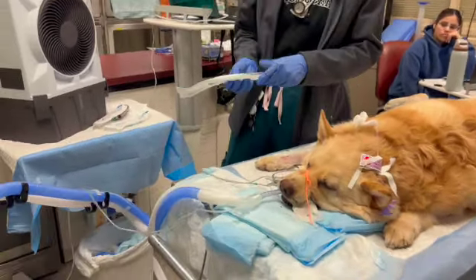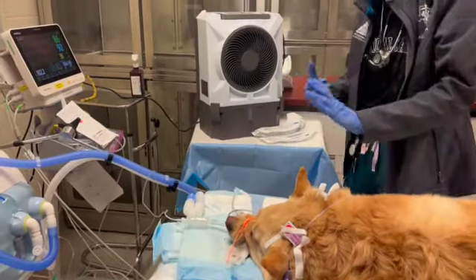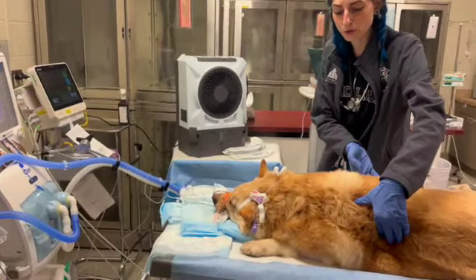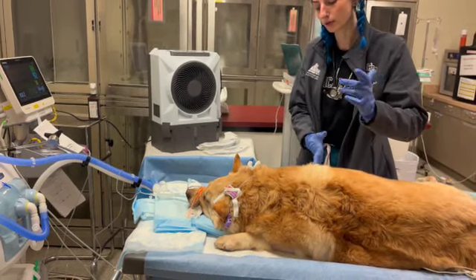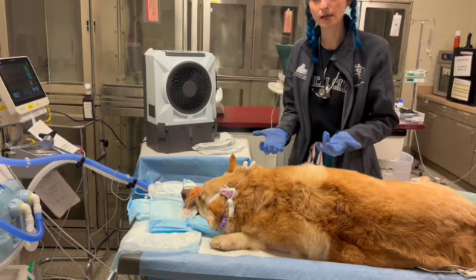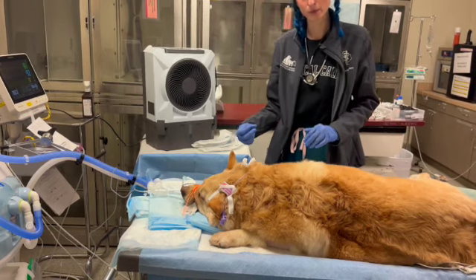And then once your patient is intubated, in order to assess if the patient has been intubated appropriately, you would be able to scope both sides of the chest to ensure that you hear lung sounds on both sides and not just a single one. If you hear lung sounds on just a single side of the chest, that could be an indicator that only one bronchus has been intubated, and maybe your tube needs to be backed out a little bit.